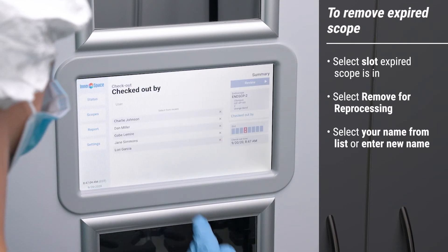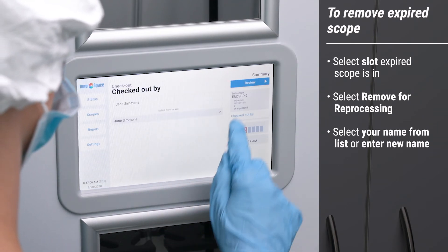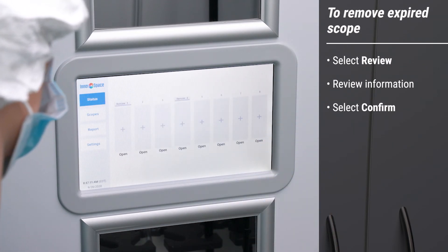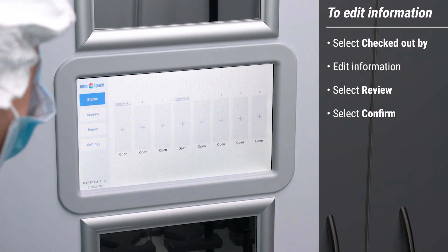Select your name from the list, or enter your name if new to the system. Select Review and review the scope information. If correct, select Confirm. To edit the information, select Checked Out By, then Edit Information, select Review, and then Confirm.